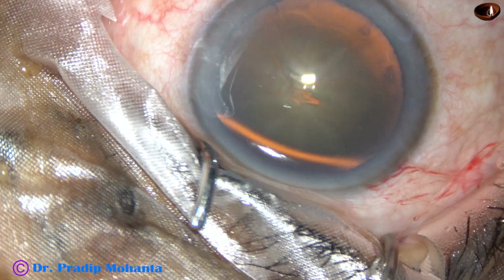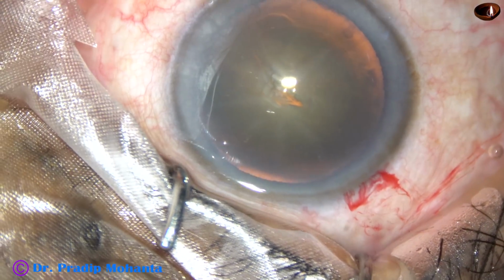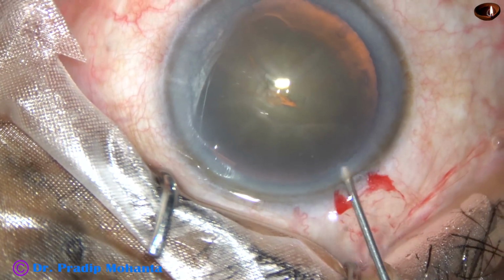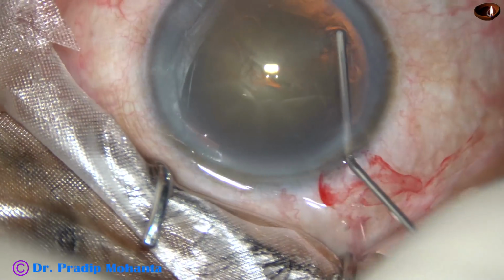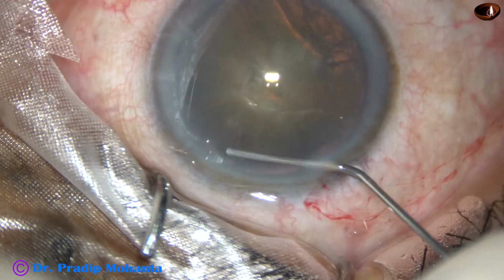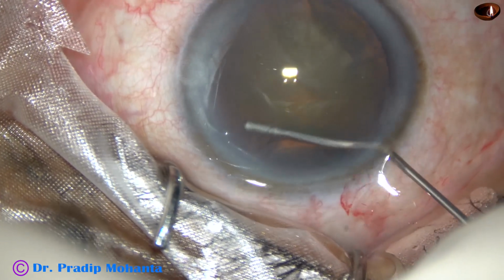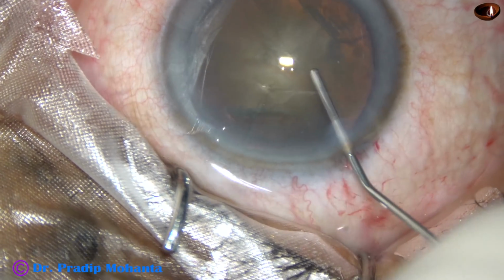And now hydrodissection. BSS is passed just under the anterior capsular rim and the fluid wave goes towards the opposite equator. Hydrodissection is done from another point.